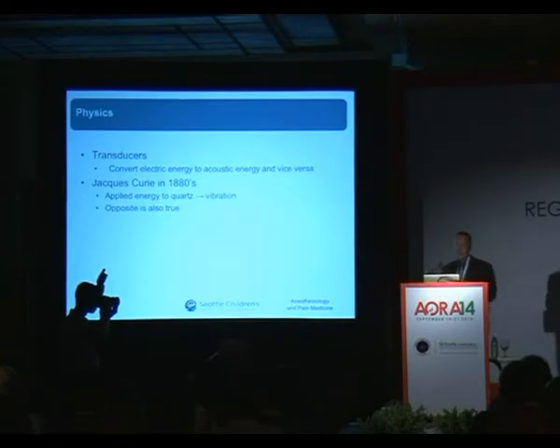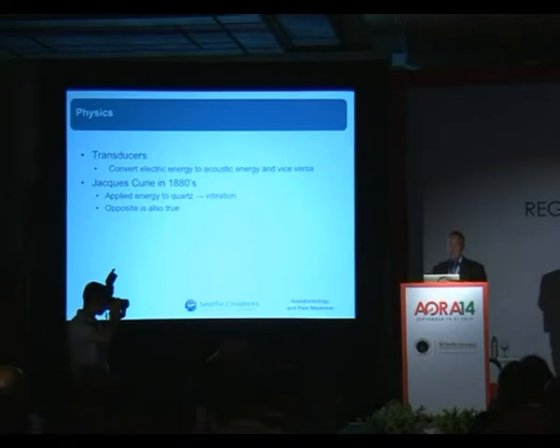So remember that transducers are devices capable of converting energy from one form to another. The transducers in ultrasound probes convert electric energy to acoustic ultrasound energy, and then convert ultrasound energy back into electric energy.